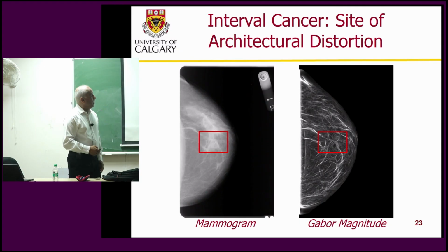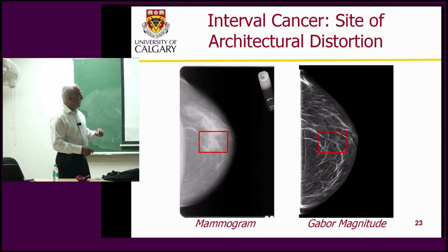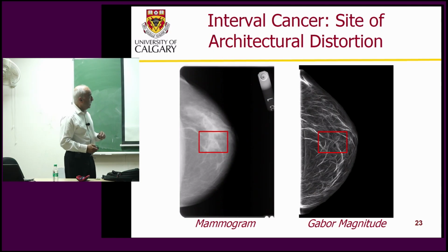So Dr. Desautels marked these regions and said these are where the cancer was indicated to have developed, and these are the suspicious regions related to what could be architectural distortion. So this database is sort of uncertain, but there is something happening there, is the point. And we said there is architectural distortion, and Dr. Desautels said, yes, there is something there.